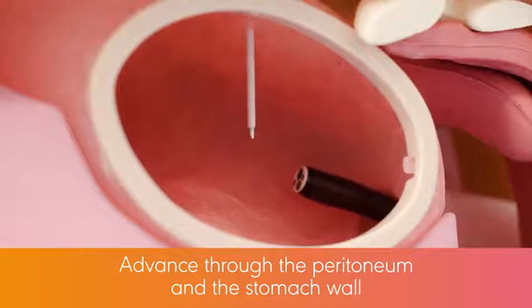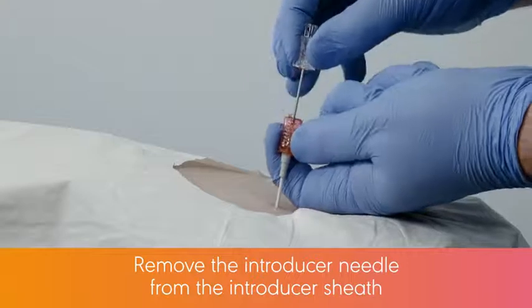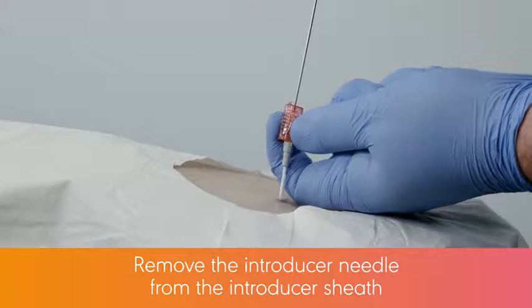When the Introducer Safety Needle is observed in the stomach, remove the Introducer Needle from the Introducer sheath by firmly holding the Pink Safety Locking Collar and pulling back on the needle hub.